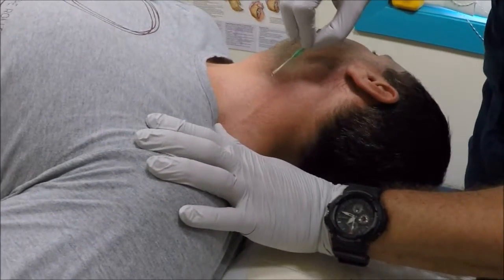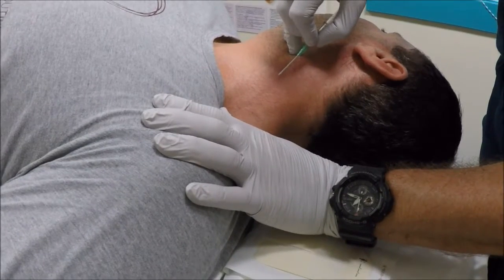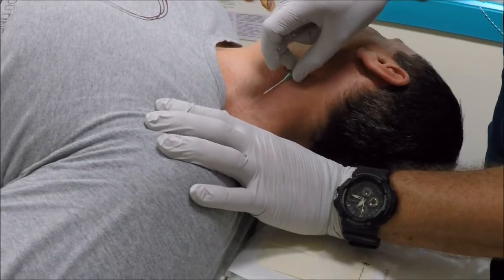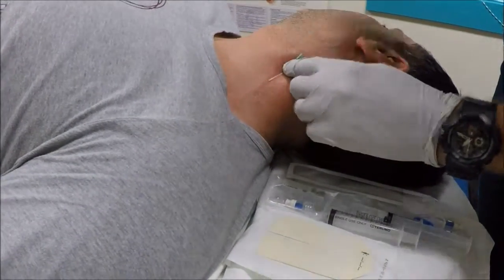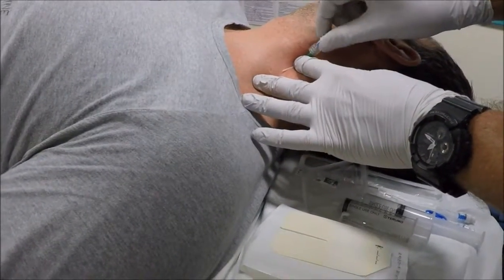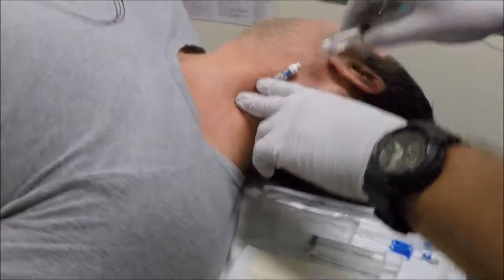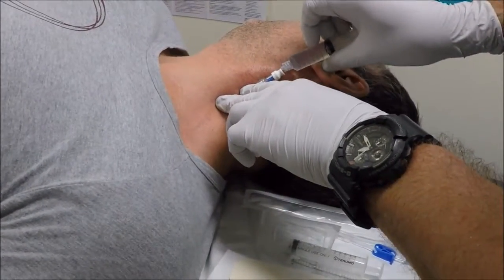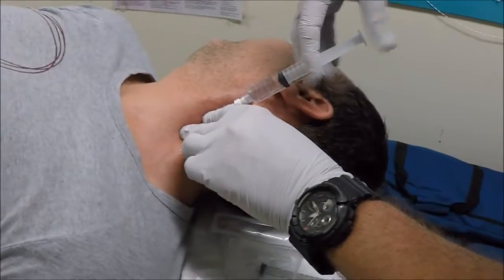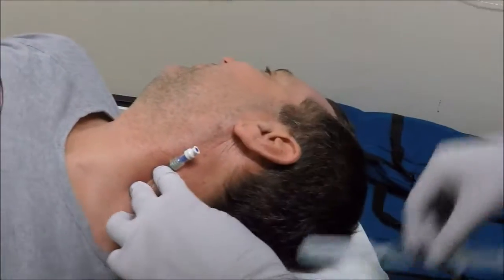So we'd be extremely careful of needle stick injuries. Once we've tamponaded the vein, at 15 degrees we'd puncture into the EJ vein. I won't do it because it's beyond my skill set, and once the cannula is engorged, we'd look for flashback into the cannula, occlude the EJ vein, put on a bung, and with some saline flush, confirm placement by positive saline flush. Or we could aspirate blood off at the same time to ensure that we've got a patent cannula.